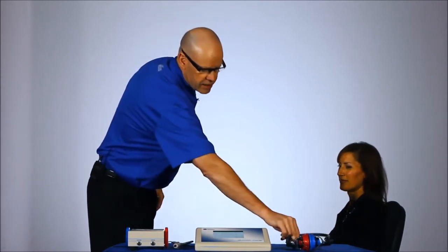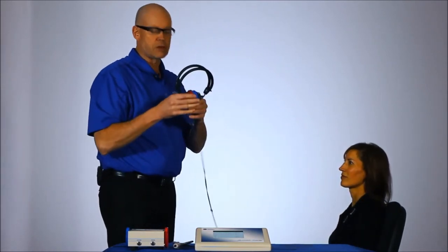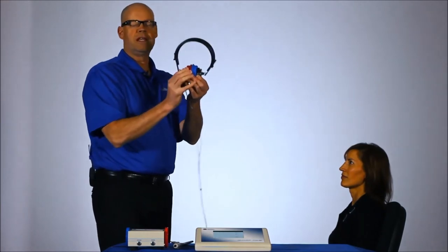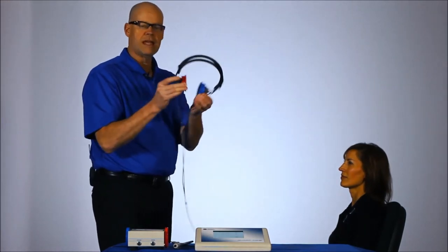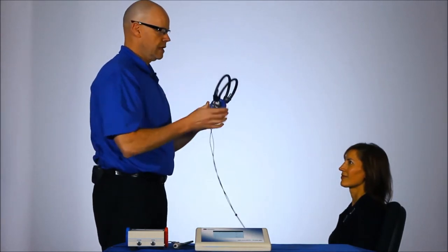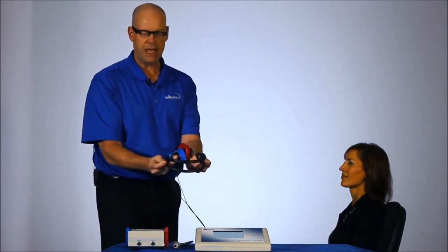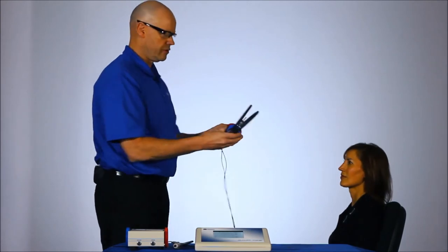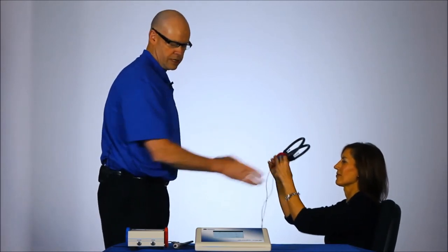Right now I'd like to run a test with a test subject. I'd like to thank Delia for volunteering to take a test for us today. With any audiogram or audiometric test, using a TDH39 headset, your red is always your right ear and blue would be your left ear. With an adjustable headband, we can make it comfortable for each individual patient. I'll get Delia to put those on and get comfortable.